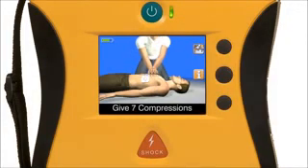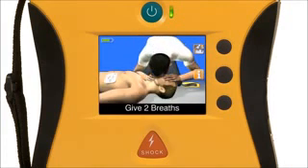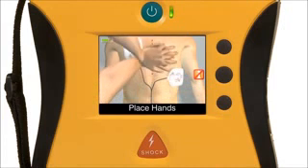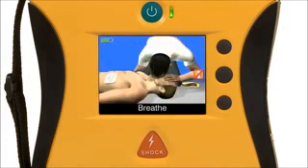Now, I'll show you a benefit of the view, which can act as both your coach and trainer when it comes to CPR. As a coach, the video will show you when and how many compressions to perform, count out compressions like a metronome. It will also show you when to give rescue breaths and when to pause for a shock if necessary. As a trainer, the video illustrates how to place your hands and how to perform compressions and rescue breathing.